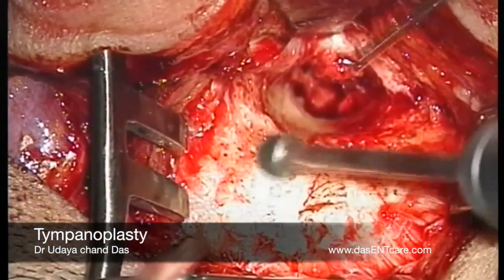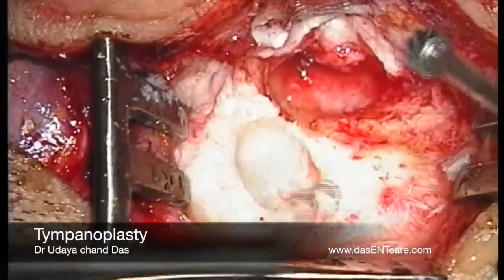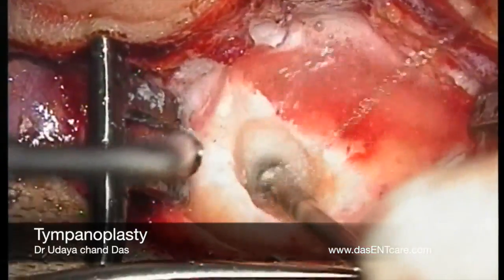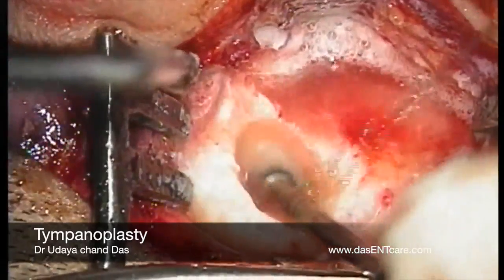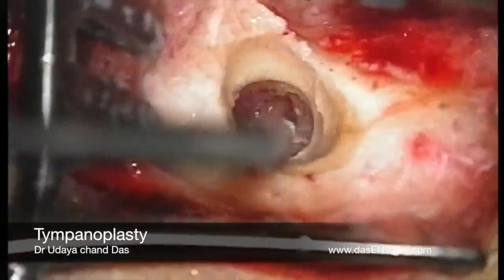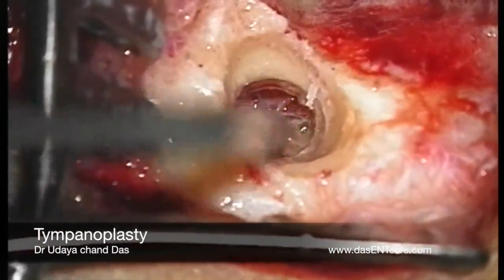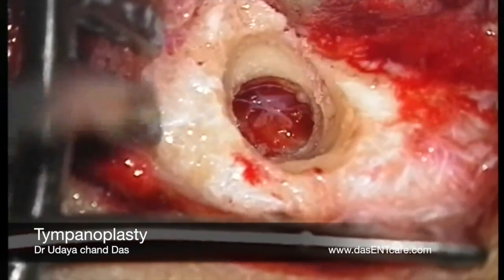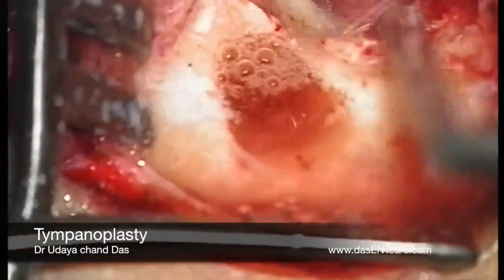If the X-ray shows sclerosis of the mastoid bone, I usually do a mastoid antrotomy. Mind you, this is not a cortical mastoid antrotomy. It is just to enter the mastoid antrum to check the patency of the aditus by flushing saline through this and observing the saline coming out from the middle. Now the mastoid antrum has been reached and there is a small polyp, so I am taking out the polyp from the mastoid antrum.